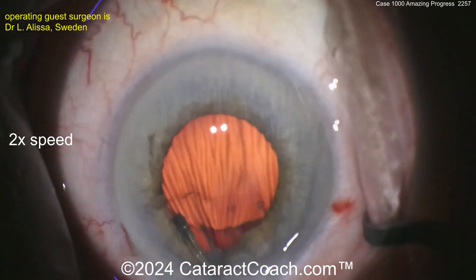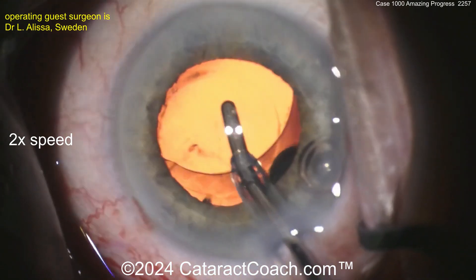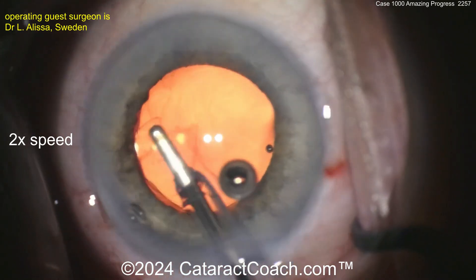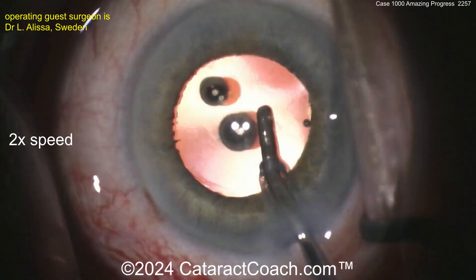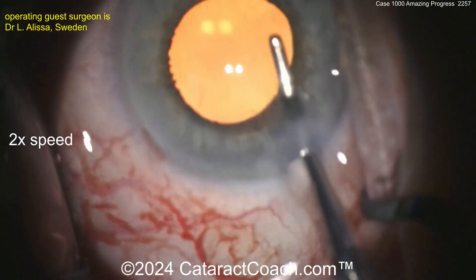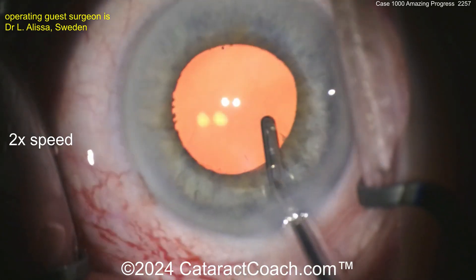Going behind the optic to remove viscoelastic. Fantastic — great job. So proud of you — you've made a lot of progress here. Your patients are obviously getting great results and are very happy.